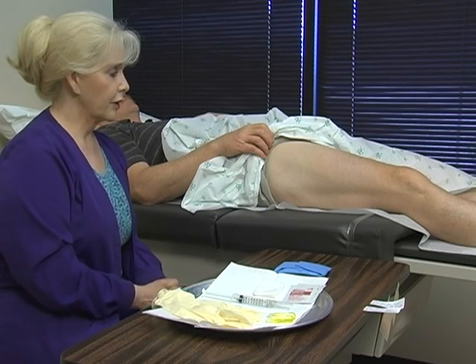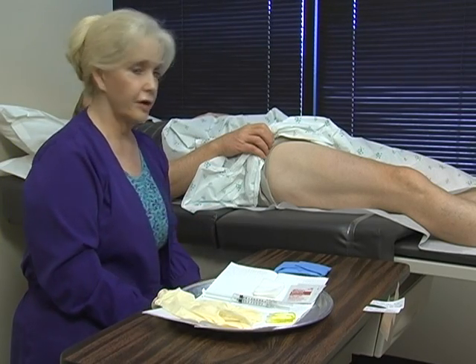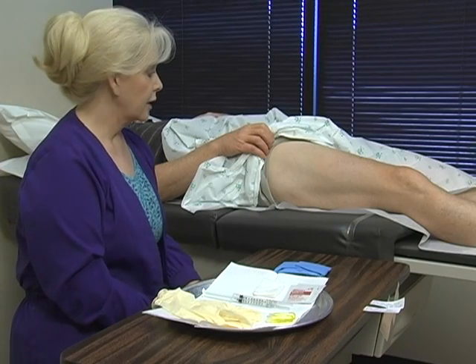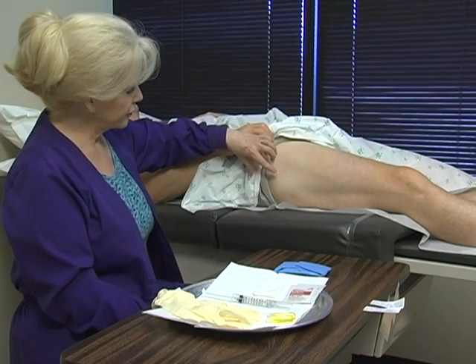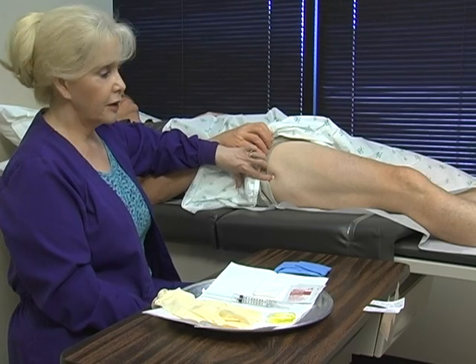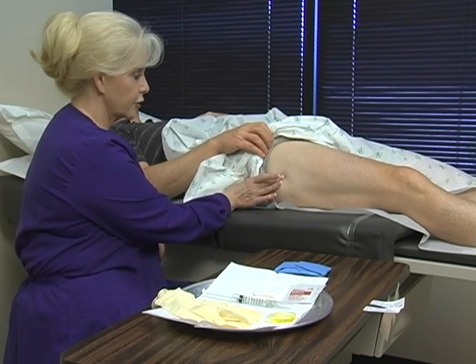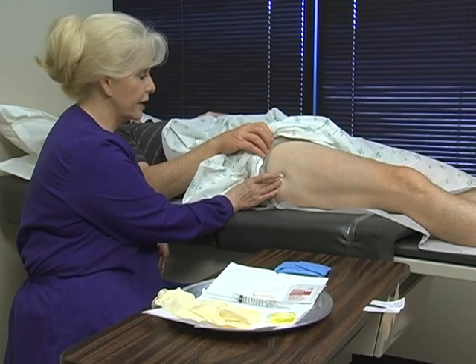We've chosen to demonstrate two biopsies — the two most common sites that we use for our epidermal skin testing. We'll use the upper thigh as well as the lower calf. In our measurements, we'll measure from the greater trochanter and measure 10 centimeters down.